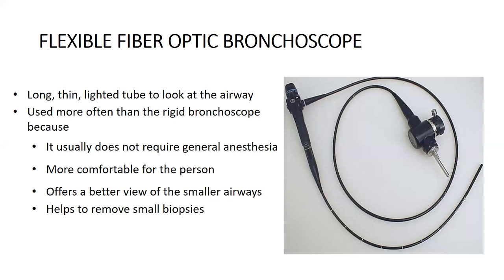Sir, Pavan, if you can just stop here. Yes, sir. If you look into the history of the laparoscope, thoracoscope, or esophagoscope, most of them started as rigid instruments. Yes, sir. And then later on, fiber optics came in. So most of the scopes, endoscopy, thoracoscopy, laparoscopy, all started as rigid scopes. Yes, sir. Continue. Yes.